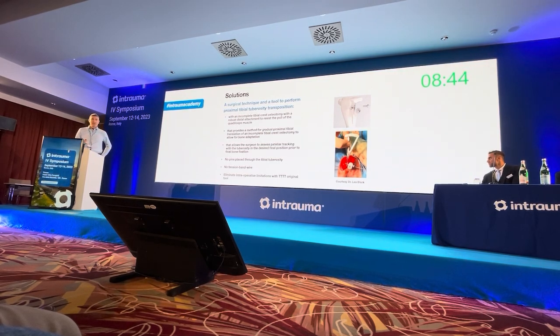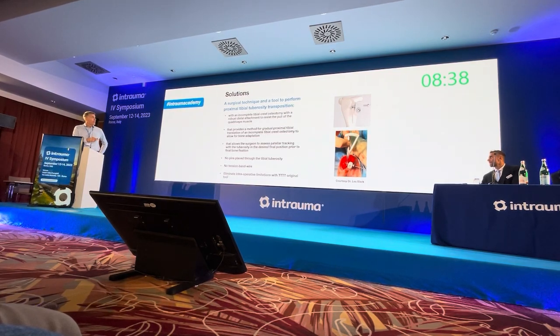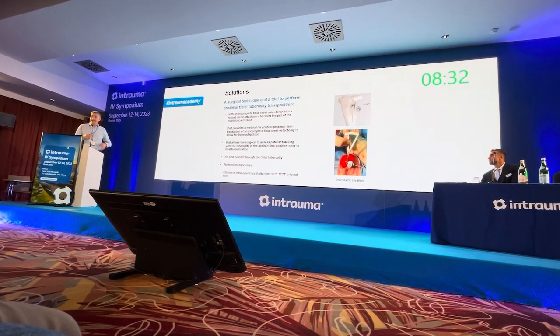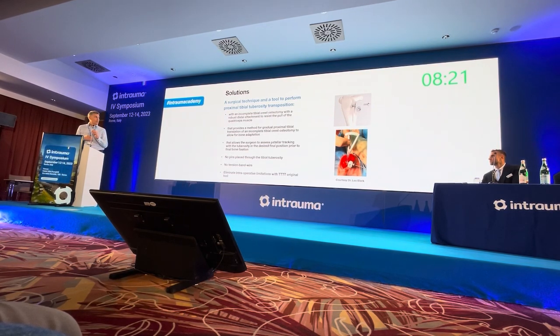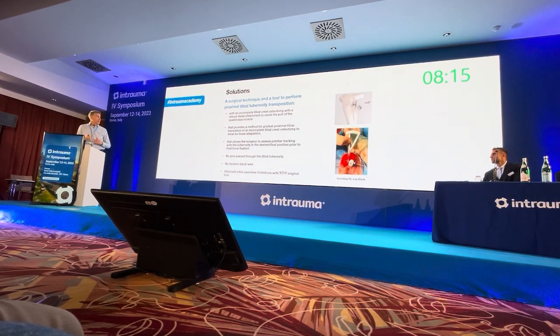And so, looking for solutions, Massimo set out to find a surgical technique and a tool that would meet these criteria. If we develop a technique and a tool that would make it possible to complete an incomplete tibial crest osteotomy that left a robust distal attachment to resist the pull of the quadriceps mechanism, would it be possible to provide a method for the gradual proximal tibial translation of an incomplete osteotomy to allow for slow bone adaptation?